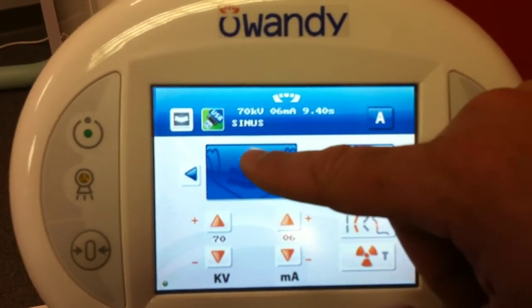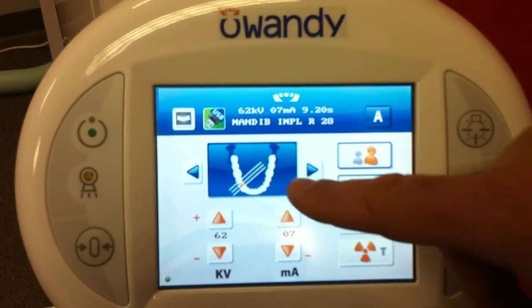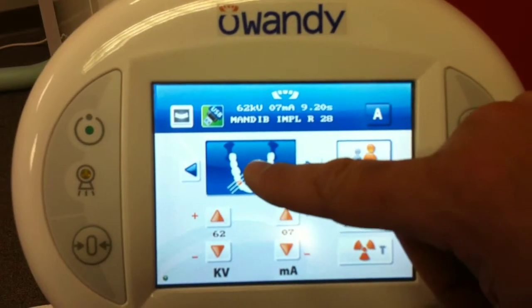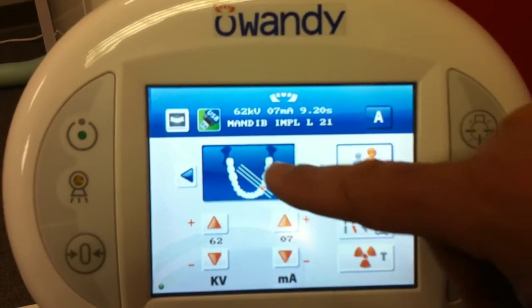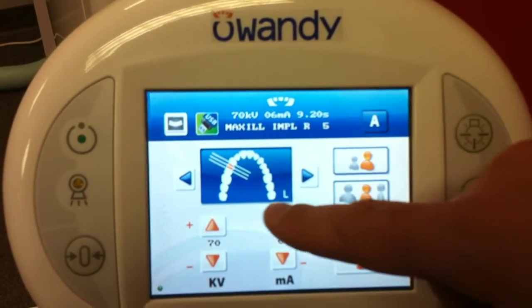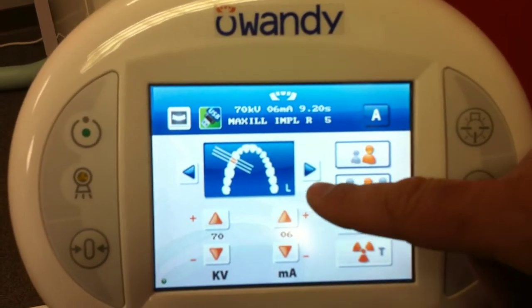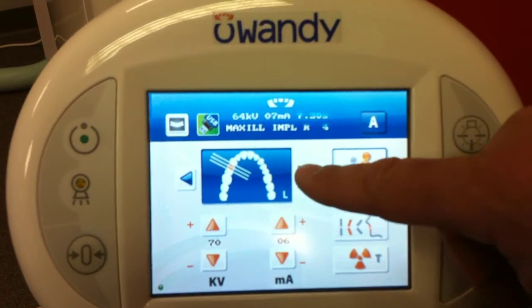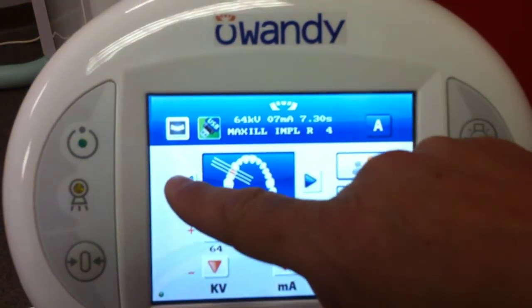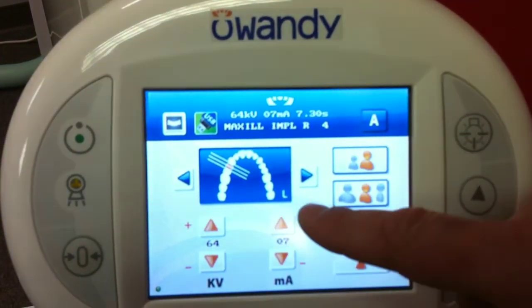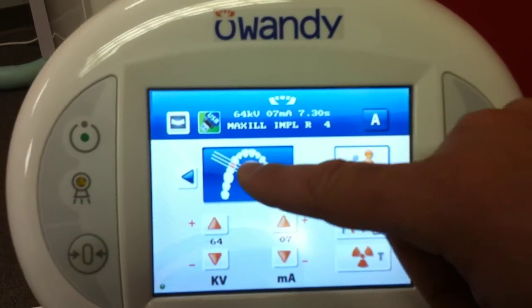After that, you have the arch selection of the different tomography modes. And when you select the actual arch, you can scroll through to select the specific tooth number for the image.